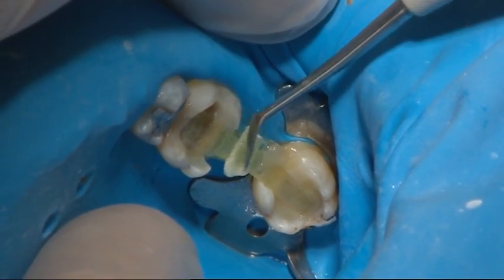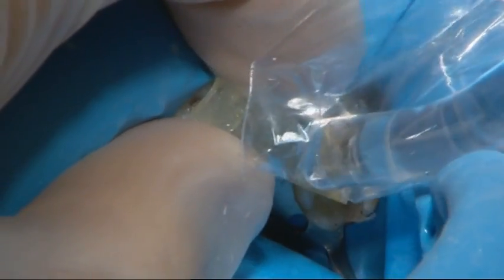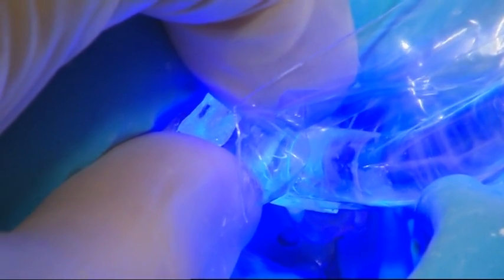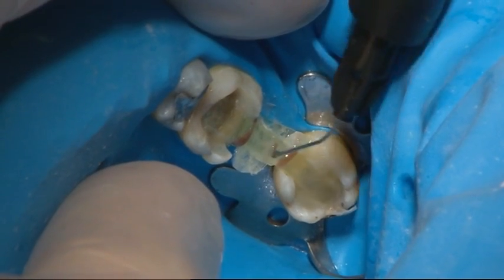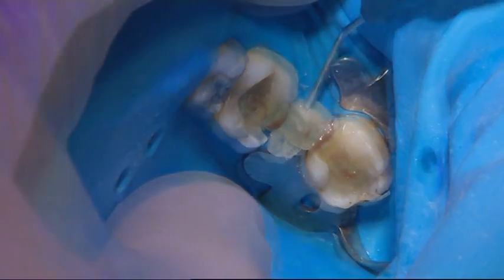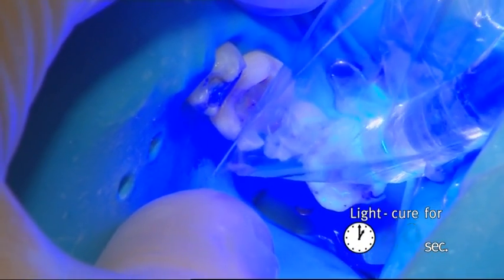Transverse fibres were added to give additional support for the composite pontic. The partially cured fibre frame was covered using flowable composite and characterisation shades, and final light curing of the fibre frame was performed for 40 seconds, one unit at a time.